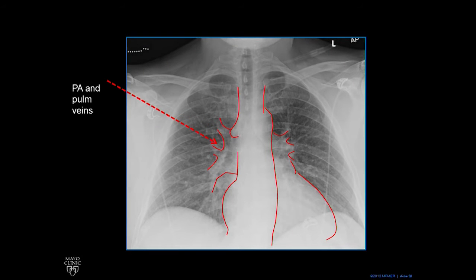This very busy area is an overlap of two types of structures. These are the pulmonary veins on the right and the pulmonary arteries on the right. So the pulmonary arteries and the pulmonary veins together overlap there.